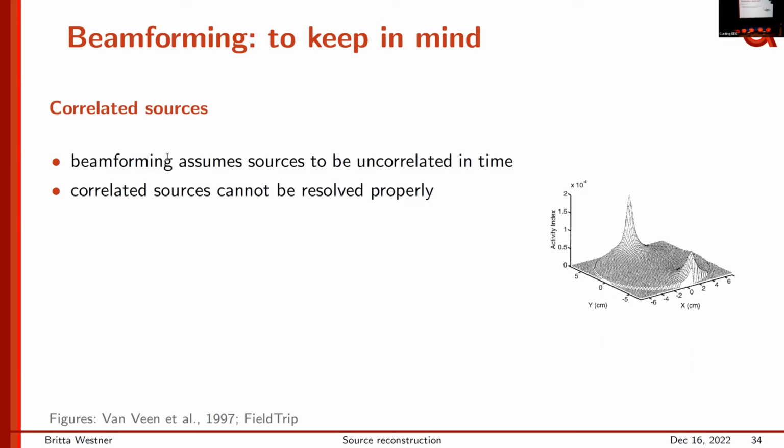When it comes to how you make your forward model, I think you really have to consider all steps. So one of them is the co-registration. And then, of course, you can be more or less realistic coming to how you model your geometry, right? You talked about a spherical model, which, of course, is not as realistic as a full BEM model.